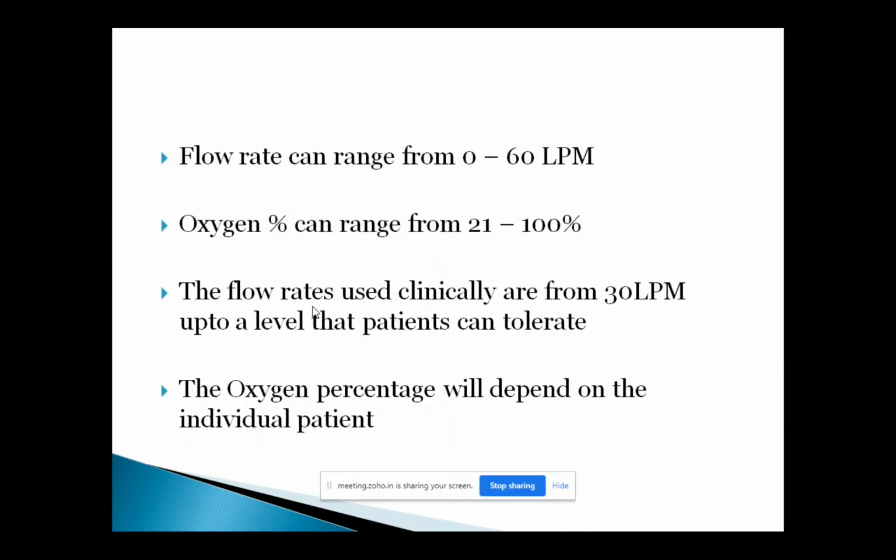So on the machine, you can set the flow rate from 0 to 60 liters. Remember, it's not oxygen you're setting, it's the flow of air from the machine. Then you can add the additional oxygen from 21% to 100%. So how can you tell it's 21% to 100%? You keep increasing the flow from the flow meter. The little device on the machine tells you, for example, if you set the flow to 30 liters and you start the oxygen from 2 liters or 3 liters or 4 liters, on the little screen, it will tell how much percentage of oxygen the patient is getting. So in that way, you know very clearly how much percentage of oxygen you are giving to your patient.